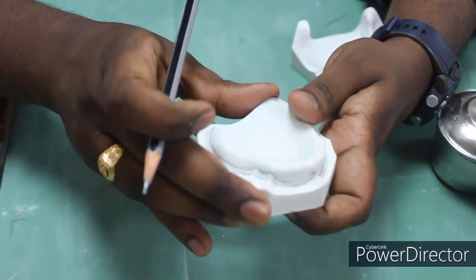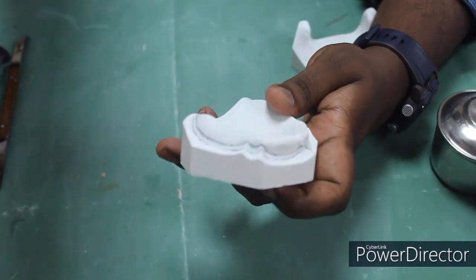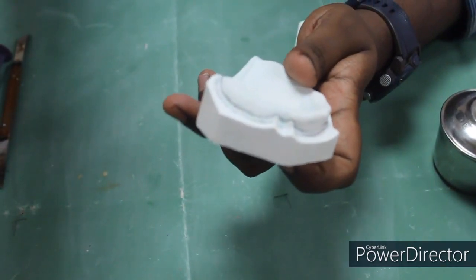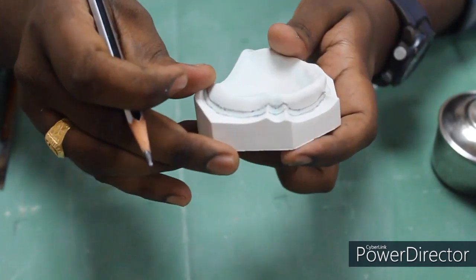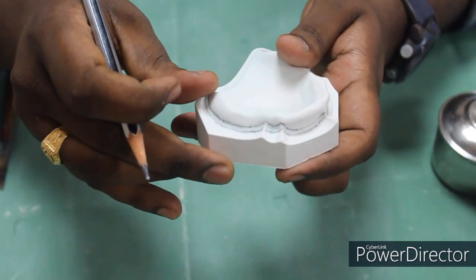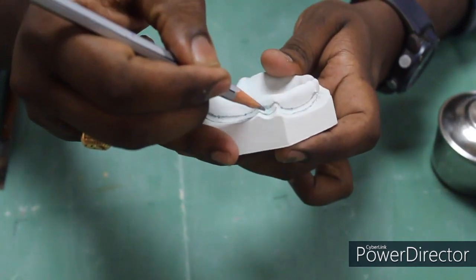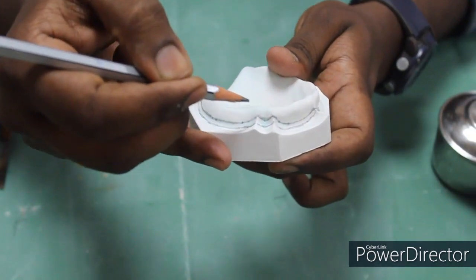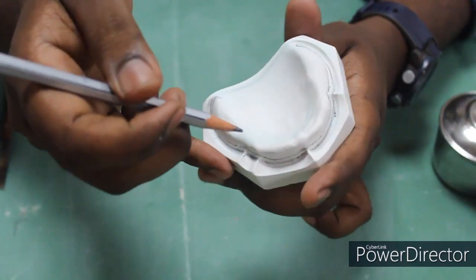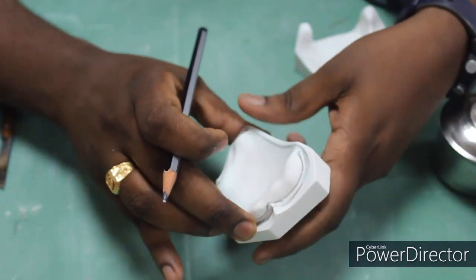So far I have drawn 2 lines. I think you can visualize it. One is the depth of sulcus, the bottommost line, and 2 mm short is the tray line. Now I am going to draw the third line, that is the spacer line.